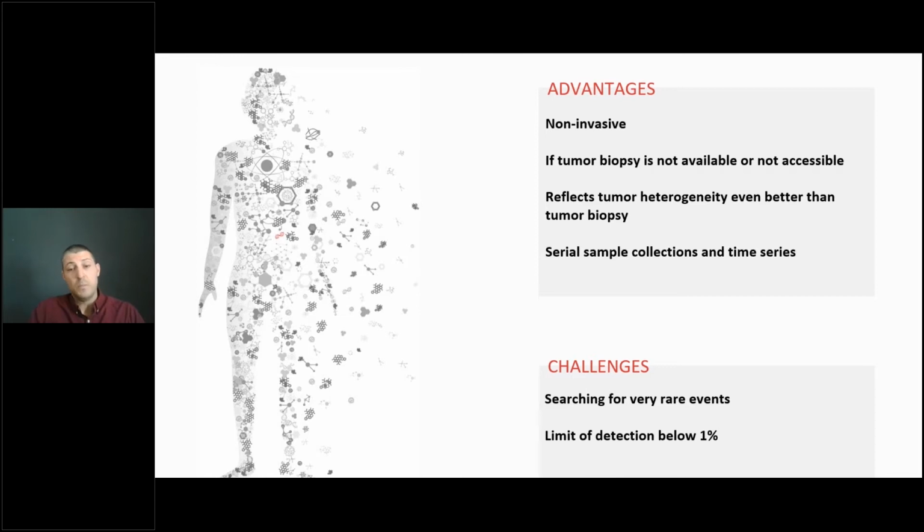Yeah, and of course there's a big challenge. We are looking for very rare events in liquid biopsy, and we have to deal with the limit of detection, which is way below 1%.